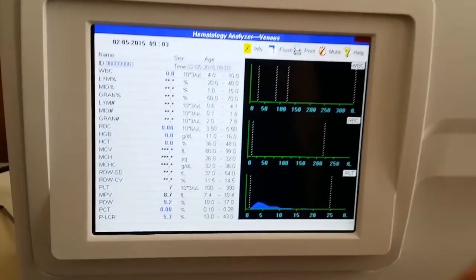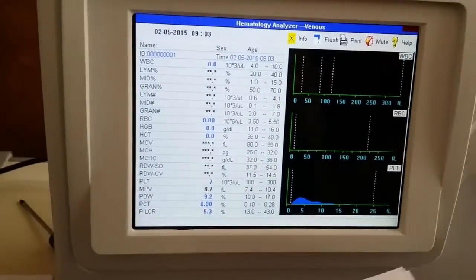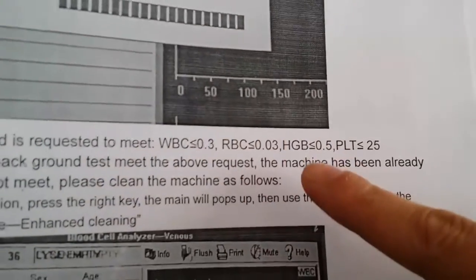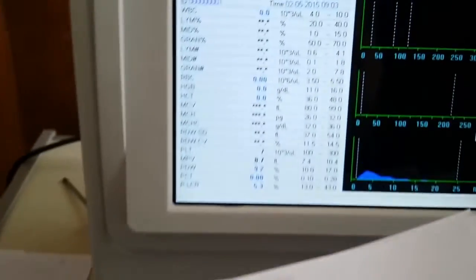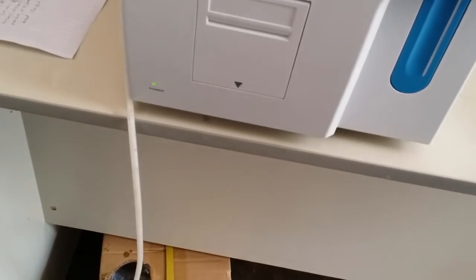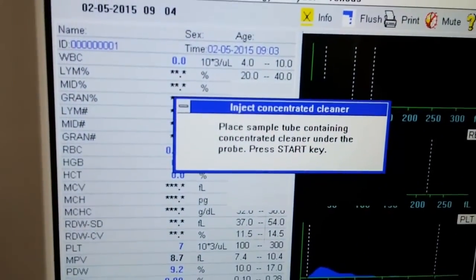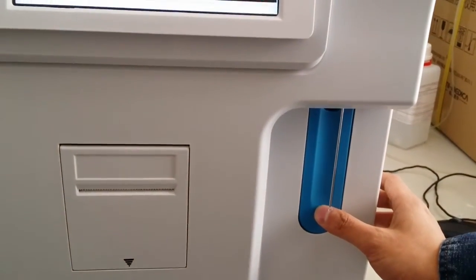Then the test result comes out. First check the WBC, RBC, HGB, and PLT are in this range. Then the background test is okay, and this machine is ready. If the result is not in this range, then you should use the function to service — enhanced cleaning. And do each step as the interface informs.